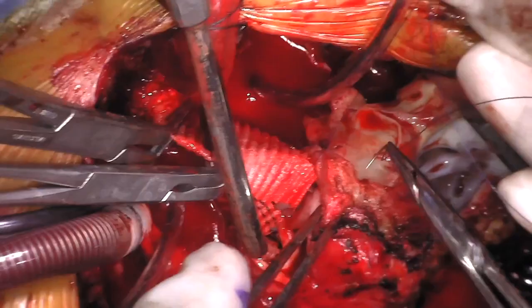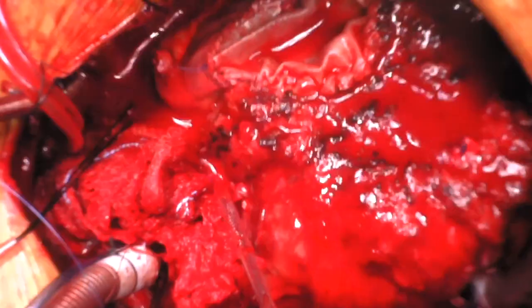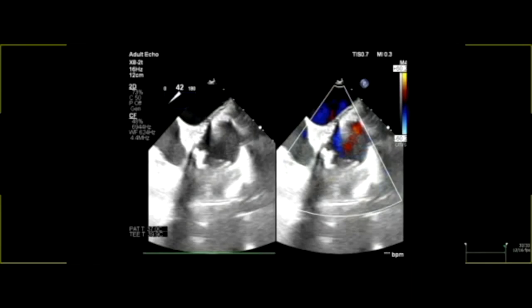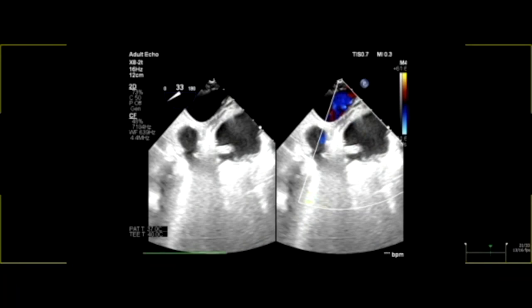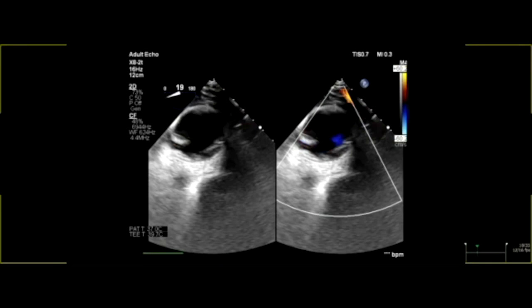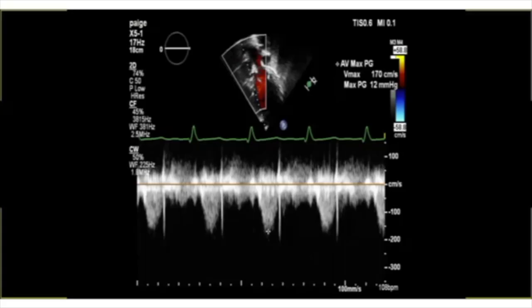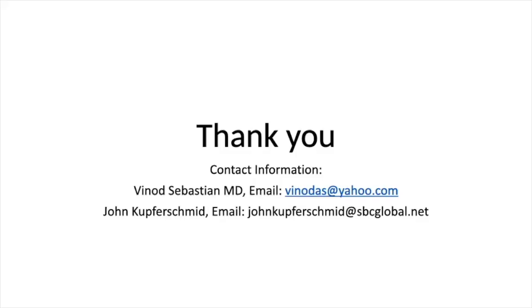Left coronary sinus tissue is resected and the aortic root is anastomosed to the 28 mm Hemashield graft. The RV-to-PA conduit was replaced with a 29 mm freestyle conduit. Patient weaned off bypass easily. Postoperative TEE shows mild aortic insufficiency with the annulus significantly downsized. Postoperative transthoracic echocardiogram also showed mild aortic insufficiency with a gradient across the aortic valve of 12 mmHg. Six-month follow-up transthoracic echo shows stable aortic valve function.